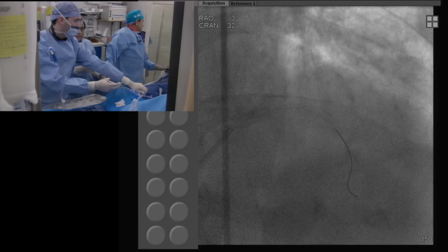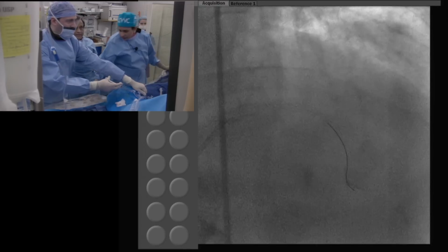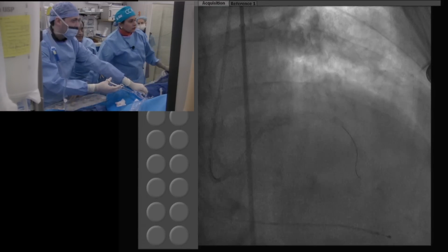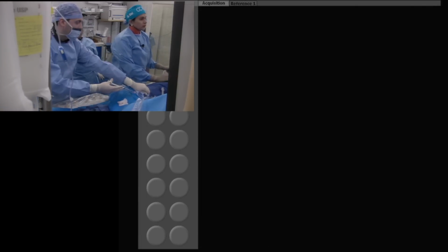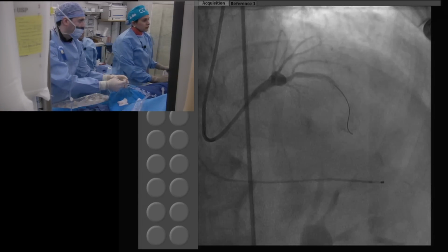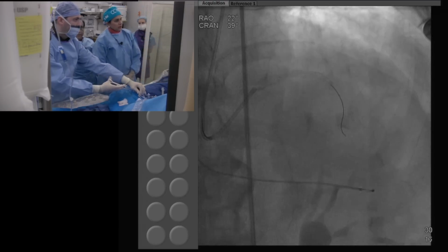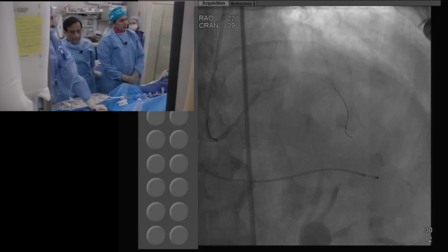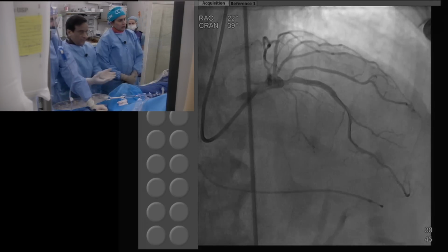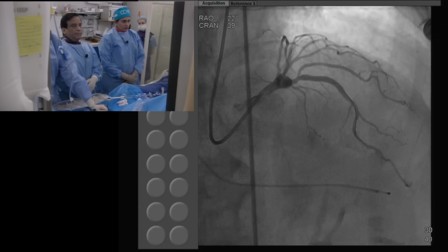Now, if this patient's aneurysm is like 2 centimeters, and we want to measure it, there are rare cases of coronary aneurysmal rupture, and that usually is when you get to about 25 millimeters. In those cases you need to follow them non-invasively by CAT scan, which would be reasonable. Here we have an old angiogram. It has become a little bigger than last time, but that's okay, because our intervention is not going to change the strategy based on that aneurysm.